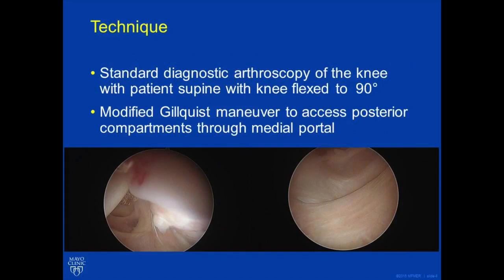First, a standard diagnostic arthroscopy is carried out with the anterior medial and anterior lateral portals established at 90 degrees of flexion. Once the surgeon is ready to proceed to access the posterior compartments, a modified Gilchrist maneuver is performed passing between the medial femoral condyle and the medial border of the PCL, which can be seen in the left-hand picture, and subsequently the posterior compartments of the knee can be visualized as seen in the right-hand picture.